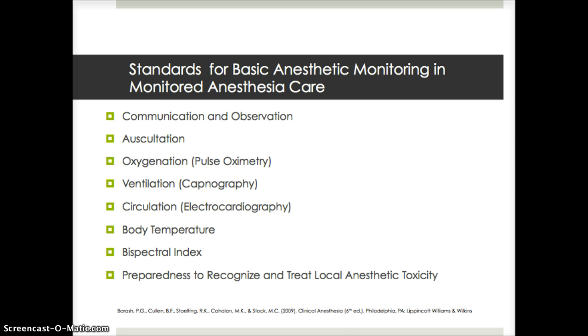Let's now discuss the monitoring standards for providing monitored anesthesia care, whether it is in the operating room or any other settings. The standards set by the American Society of Anesthesiologists for monitored anesthesia care are applicable to all levels of anesthesia, which means that the expectation for out of operating room are the same as in any practice locations, keeping in mind that our main goal is patient safety while minimizing physical discomfort and pain and allowing controlled movement for the performance of the procedure, as well as the return of patient status that is safe for discharge.